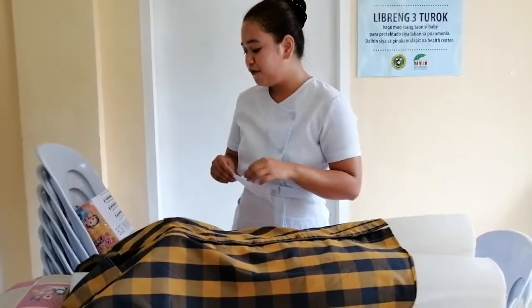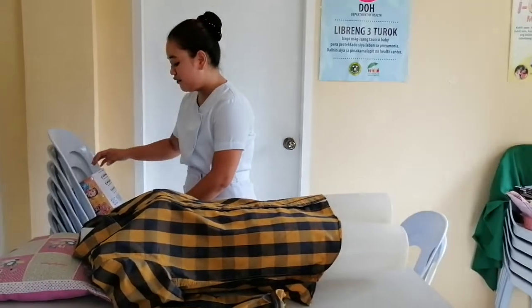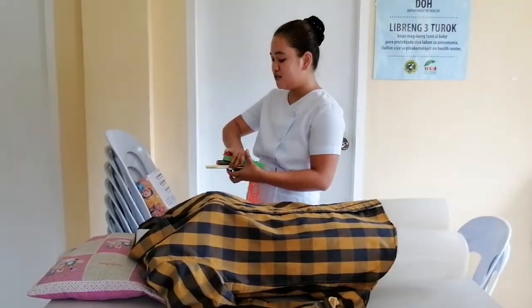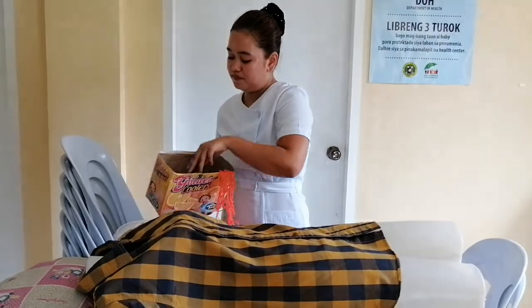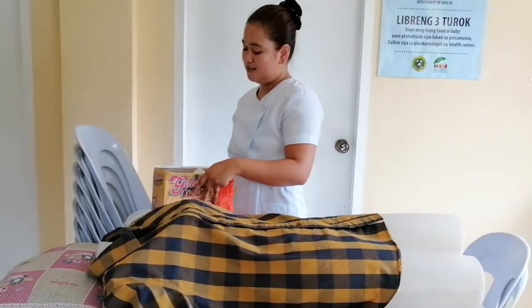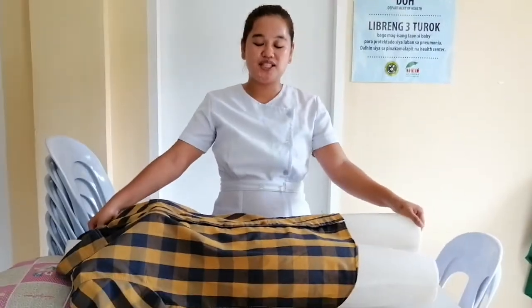Then after doing that, you're now going to do aftercare. All the materials you used, you need to properly return them to the right place. That's all for my ECG demonstration.